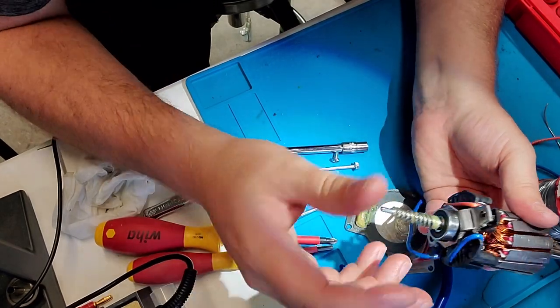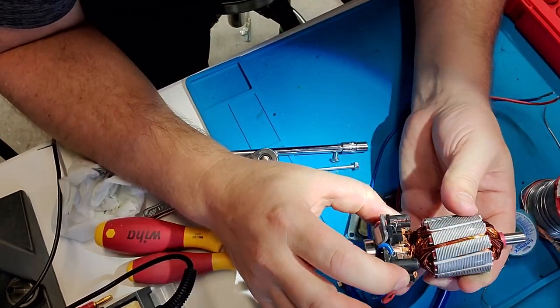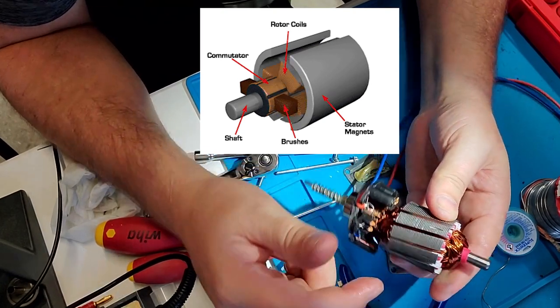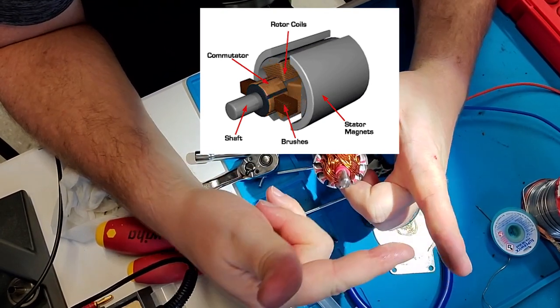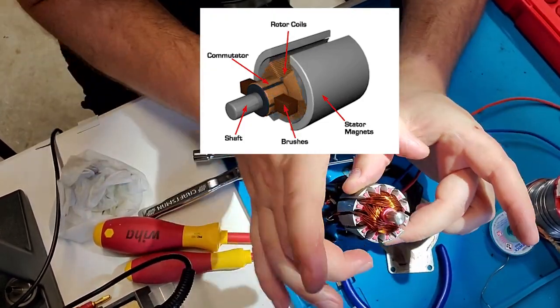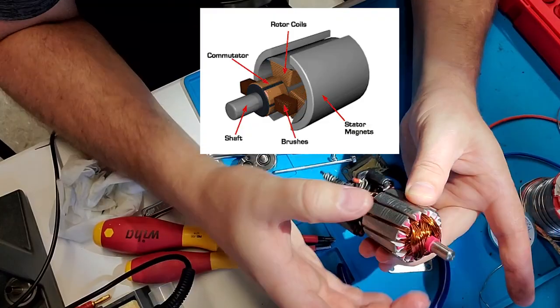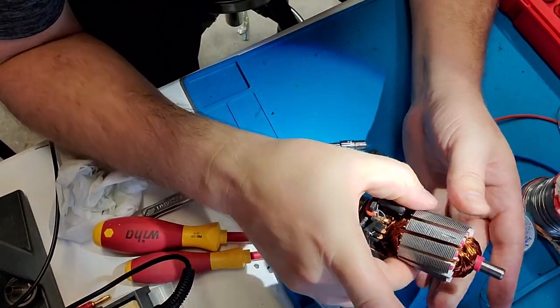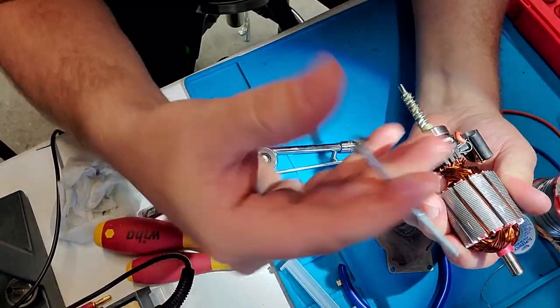So as you power these guys up, you can see that there are little commutation bars. It's those little brass pieces that line up, and the brushes will hit the commutation bars and energize them, which energizes parts of the coil. And it adjusts the north and south of the motor, which is what makes it spin. So there's a couple other things I want to point out here.